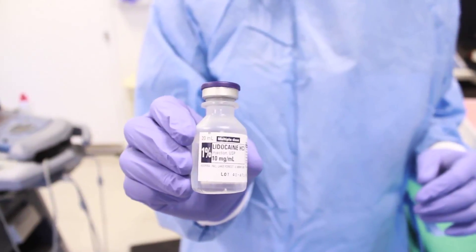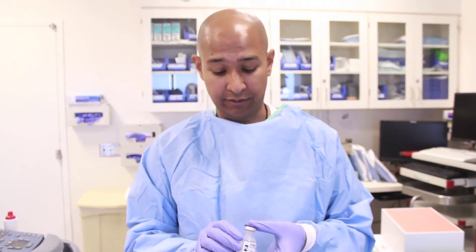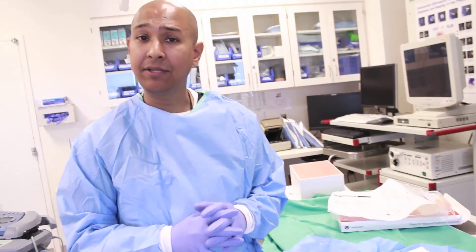Make sure you have lidocaine to help numb the skin and the tunneling tract. It's very important to make sure your kit contains lidocaine. If not, ask your nurse or staff to provide some for safe, painless placement of the catheter. Once everything is set up, we're ready to place the catheter.